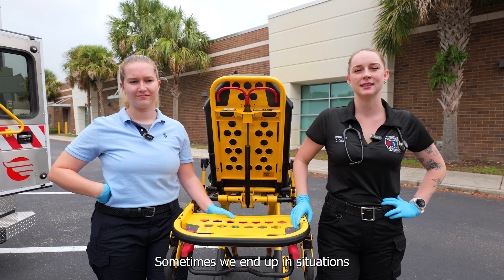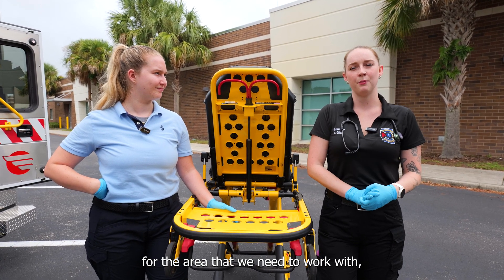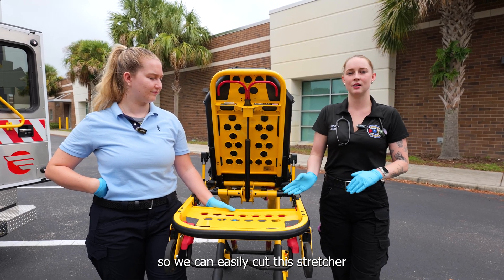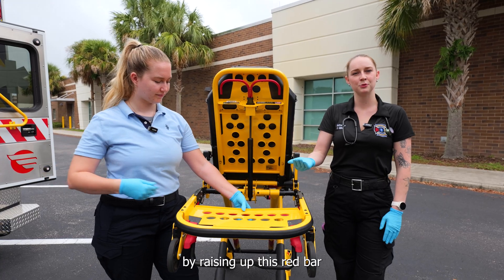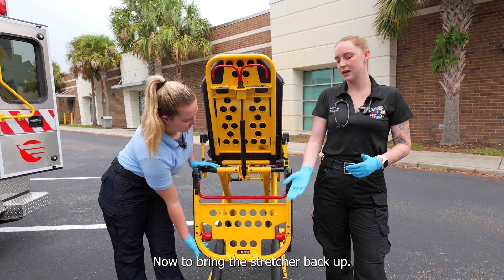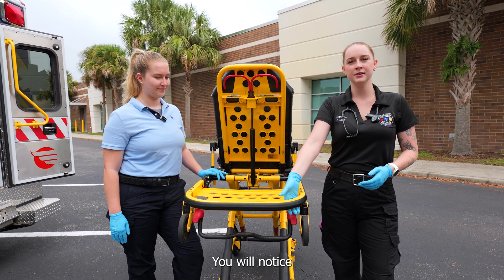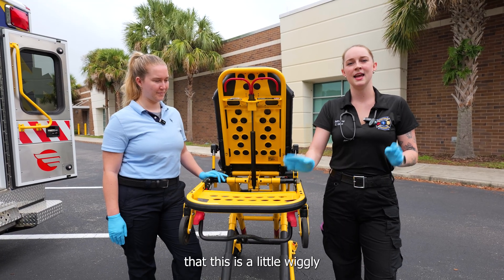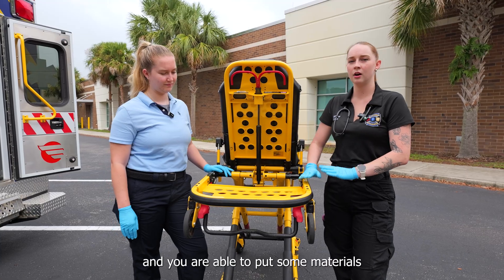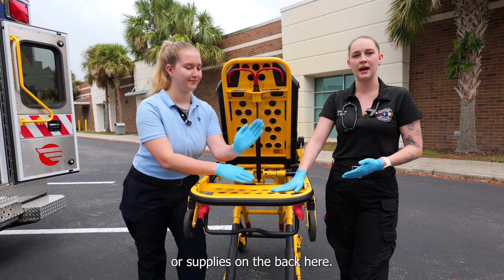Sometimes we end up in situations where our stretcher is just too long for the area that we need to work with. So we can easily cut this stretcher in half by raising up this red bar and lowering it down. To bring the stretcher back up, all you have to do is raise on the yellow bar and it will lock into place. You will notice that it is a little wiggly and that is okay — it is locked in this position and you are able to put some materials or supplies on the back here.